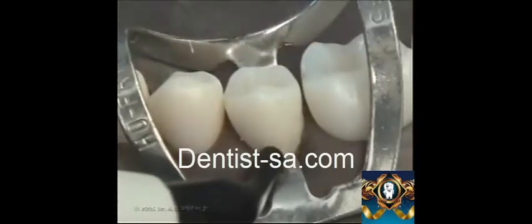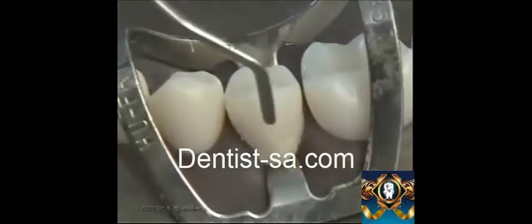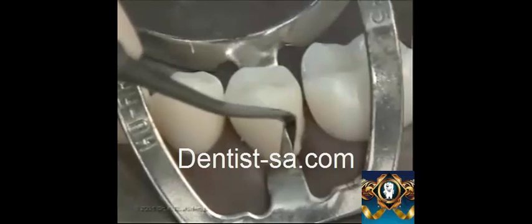The smaller second increment is now placed to get the proper contour of the restoration. Again it is placed in position using the plastic filling instrument. Any excess is now removed.